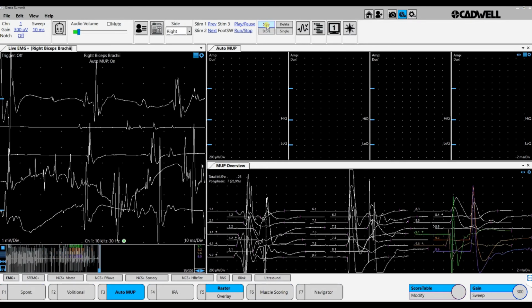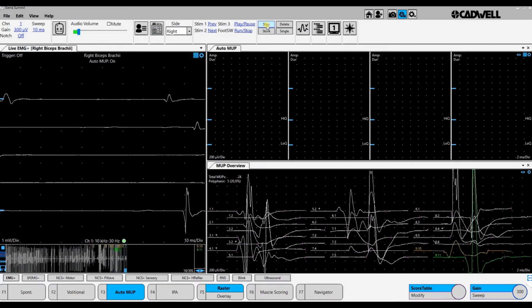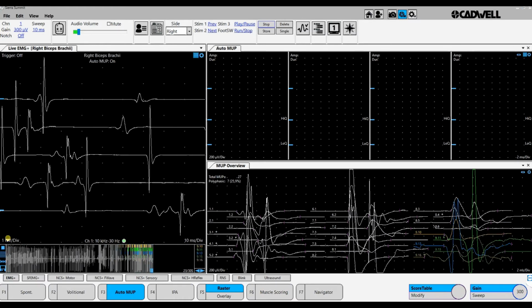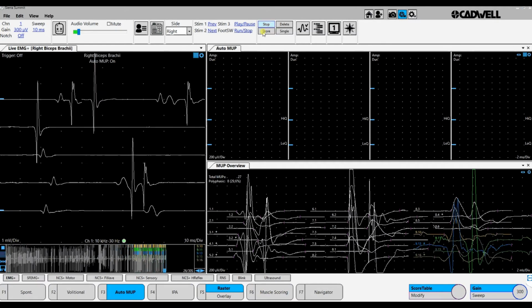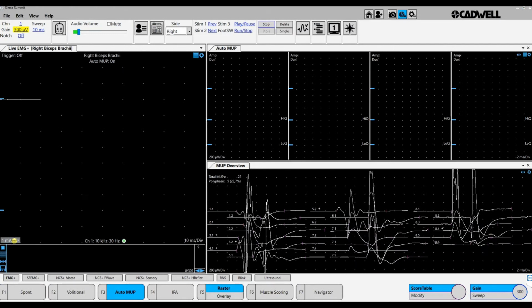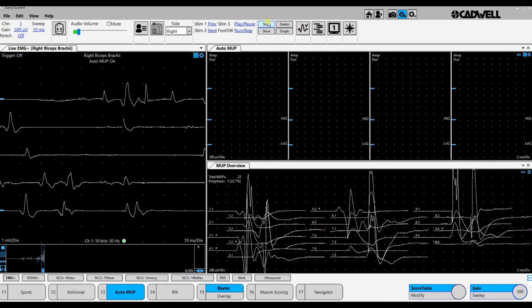Accept. We start to analyze. And then we start to analyze again.